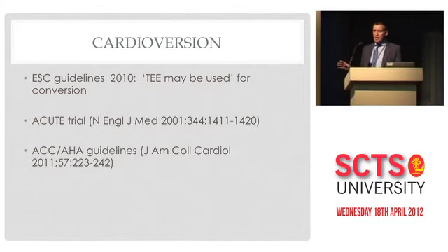So just to talk a little bit about cardioversion. It's beyond the scope of this talk. It's slightly disappointing that the cardiologists don't strongly recommend TOE, and even in the European Society of Cardiology guidelines in 2010, there's a rather tepid statement that TOE may be used for cardioversion. I think maybe as avid users, we would say something probably a lot stronger than that.